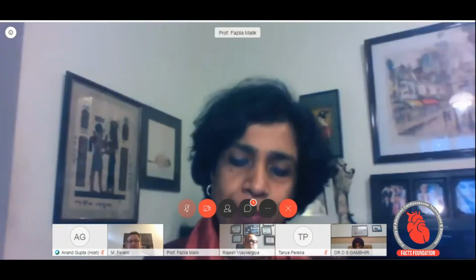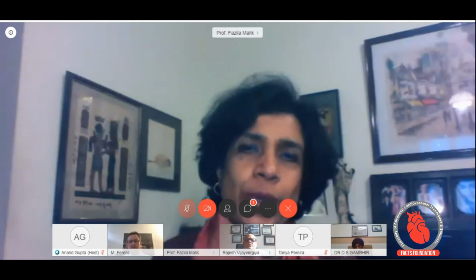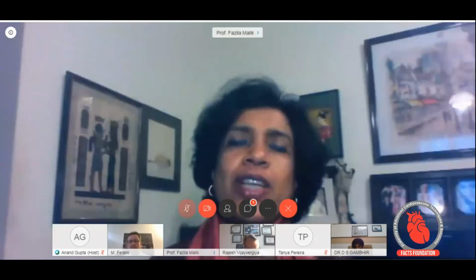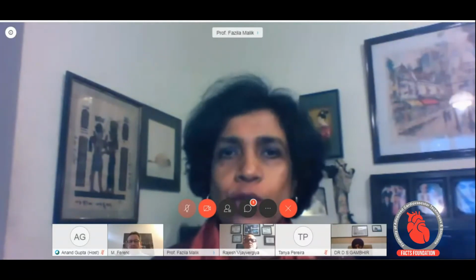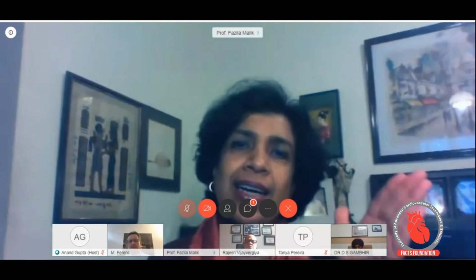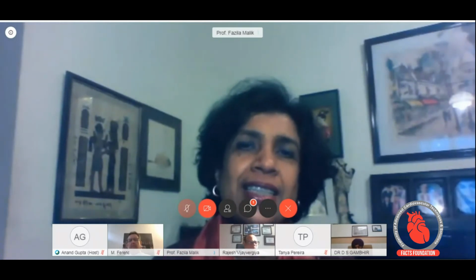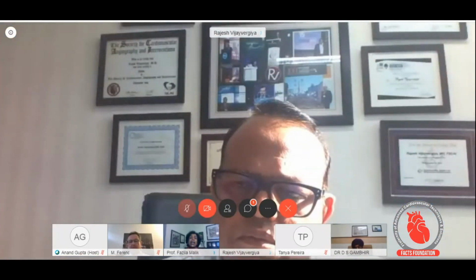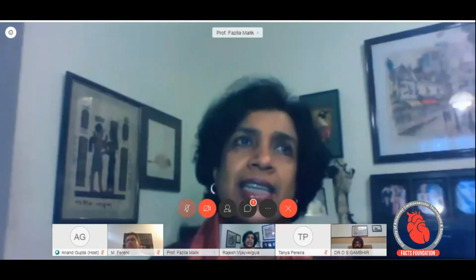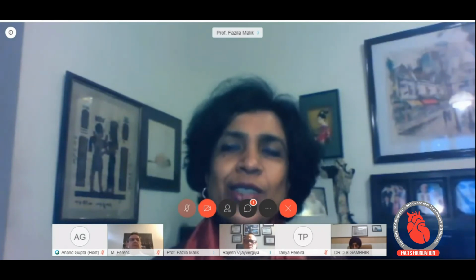Well, yes, absolutely what everyone has said, I totally agree. As I showed, they had significant disease in the ostia, which is why we covered the ostia. As a strategy, in general, if you have disease in the ostium, you can't help it; you have to do that. But if the ostia is disease free, of course you avoid that. And as Dr. Gambhir has brilliantly pointed out, because you're going with a lot of hardware, if you put a stent in the ostia, it restricts your movement, and there's every chance that you might distort the struts while doing kissing and taking balloons down. One thing is that IVUS helps you. If you see on IVUS that your ostia and its surrounding area are free, you know that you're going to get a result anyway. So, of course, what everyone has said, I totally agree.